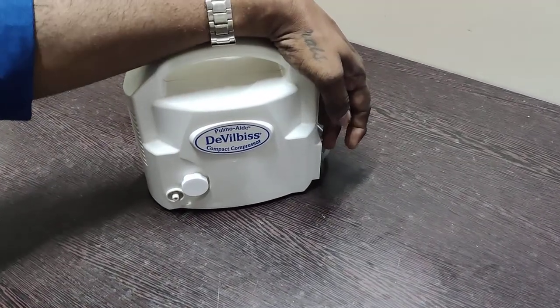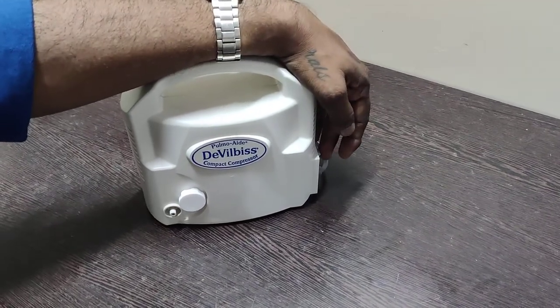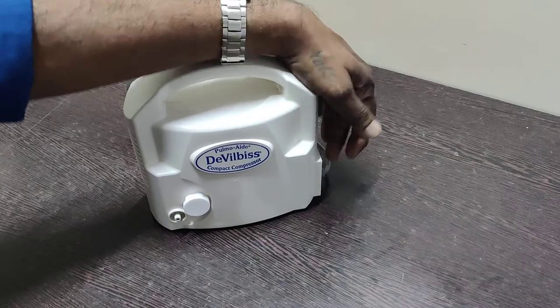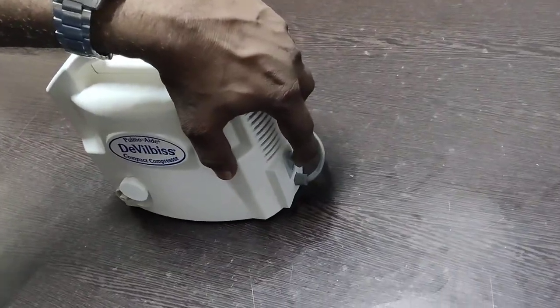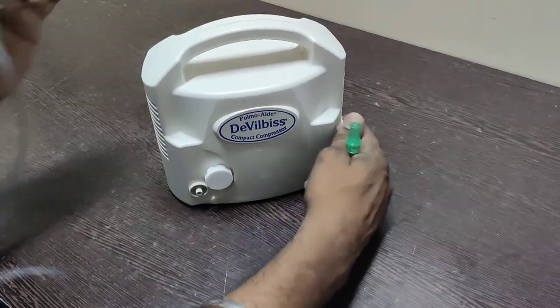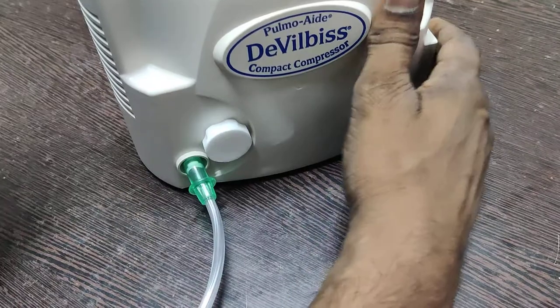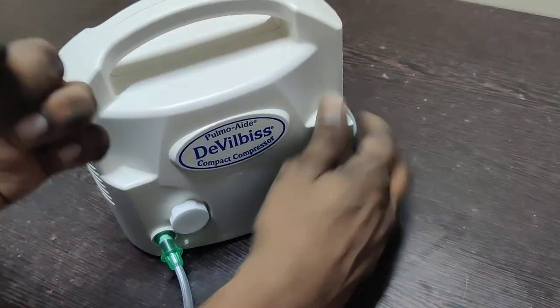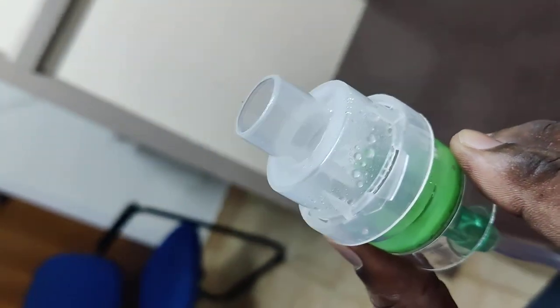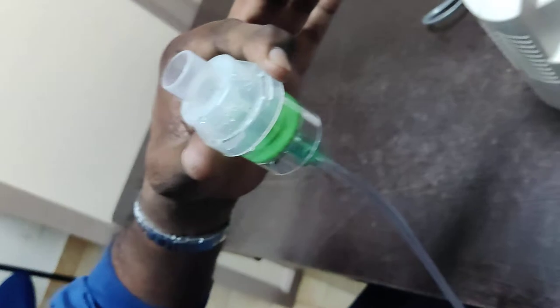This is a demonstration of the DeVilbiss PulmoAide 8 compact compressor nebulizer. It's a heavy-duty compressor ideally suited for use in a hospital environment. It's a very simple device — you have the on/off switch on the side. Once you switch the machine on, you will hear the noise, and when you connect the nebulizer chamber tubing, you will see a very fine mist produced.